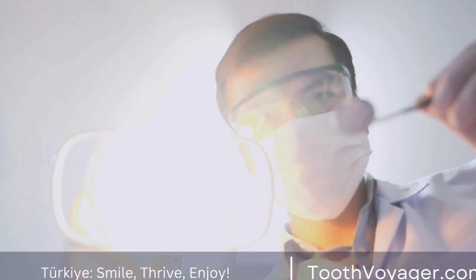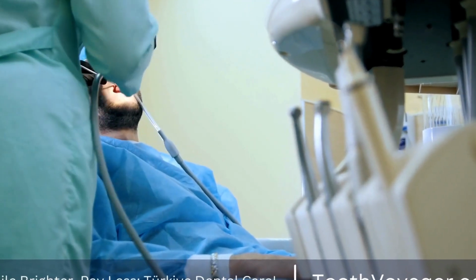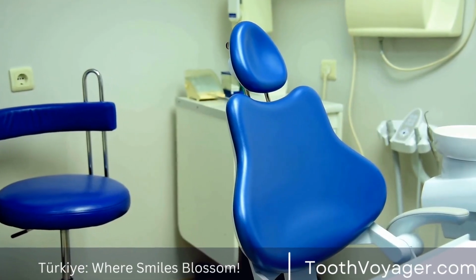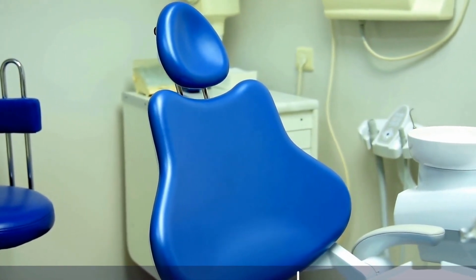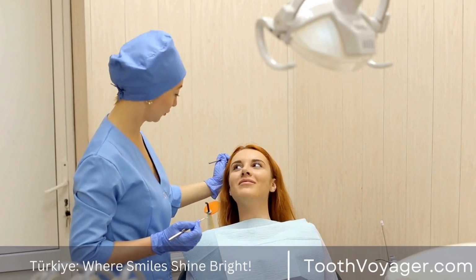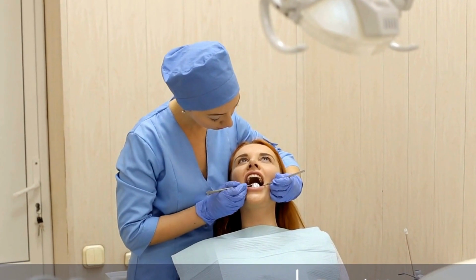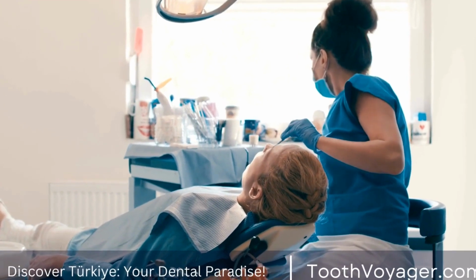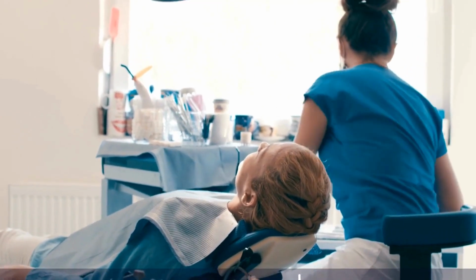CAD/CAM technology. Another major component of digital dentistry is computer-aided design and computer-aided manufacturing, CAD/CAM technology. This technology allows dentists to design and create restorations such as crowns, bridges, and veneers in a single visit, eliminating the need for multiple appointments and temporary restorations. With CAD/CAM technology, dentists can create custom restorations that precisely fit a patient's teeth, providing a more natural look and feel.